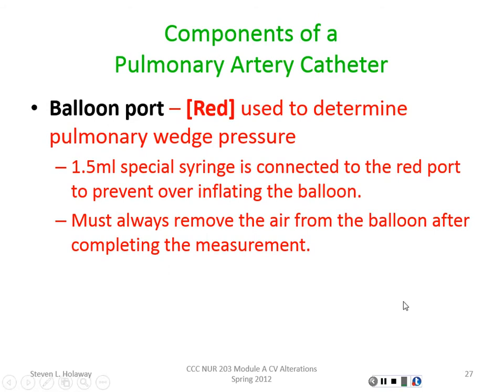We're talking about the measurements of pulmonary artery pressure and pulmonary capillary wedge pressure. This is the pulmonary artery here. So I've got my Swan-Ganz catheter laying up here. At the very tip is an opening. Here's the opening of it. I can measure pressure through that opening. When the balloon is down like this, I'm measuring the pressure within this pulmonary artery.